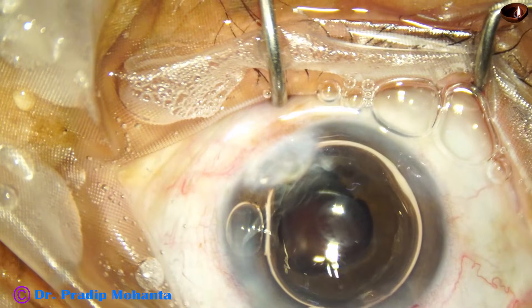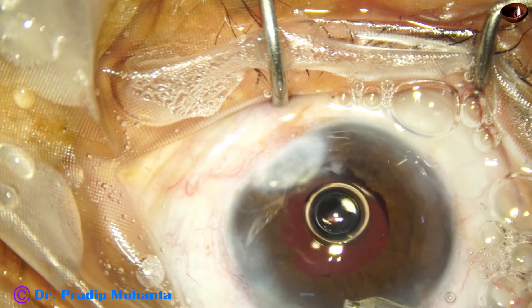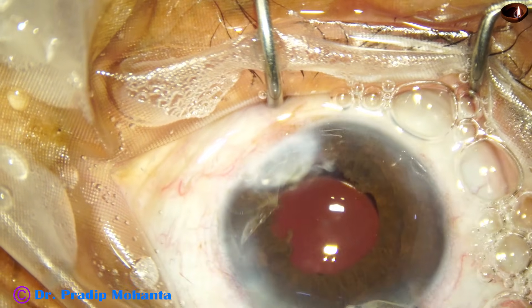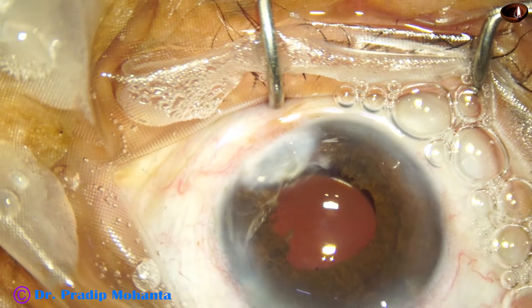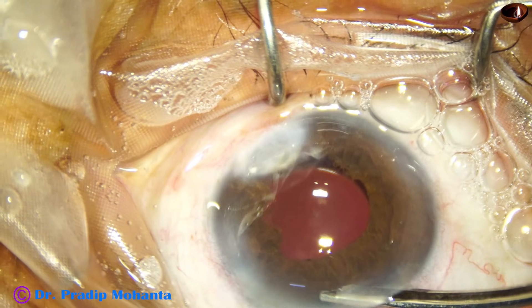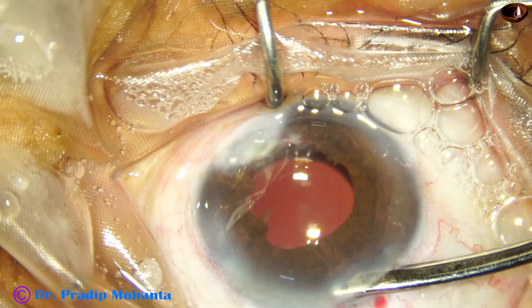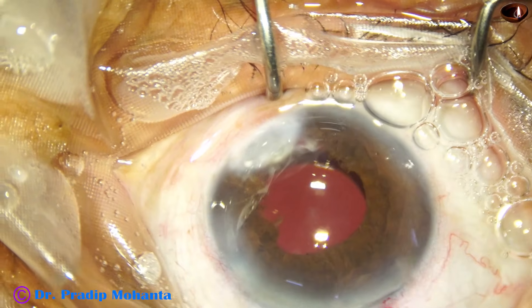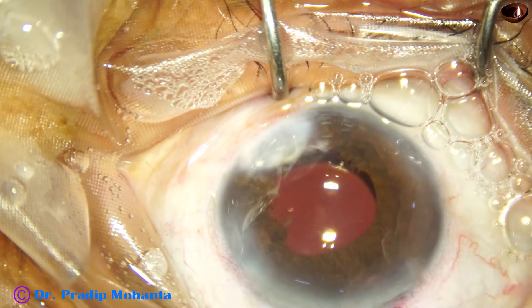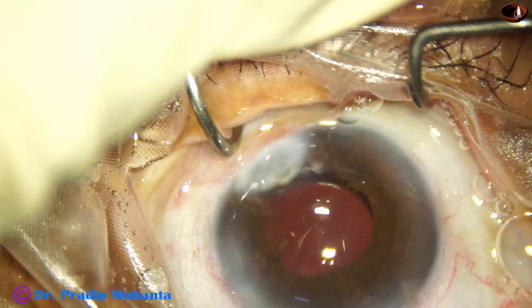I am using the 23G Simcoe and do a final lavage to remove the air bubble and form the anterior chamber nicely. We can clean the back surface of the cornea very nicely with this 23G Simcoe cannula. The integrity of the wounds is checked, a few drops of moxifloxacin are applied over the cornea, and the case is concluded.